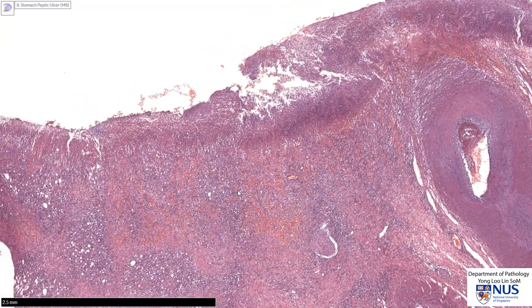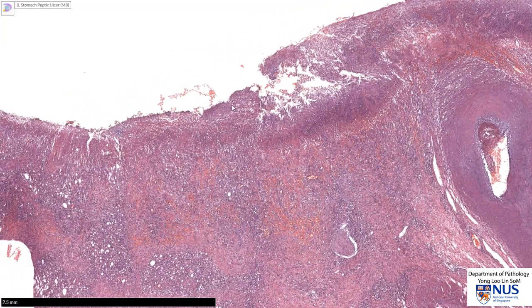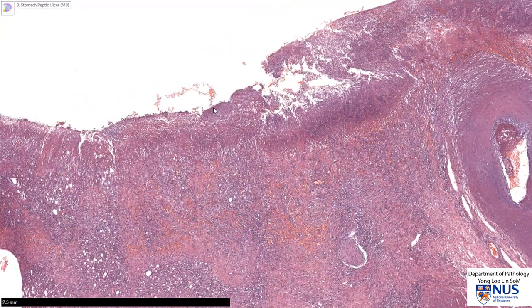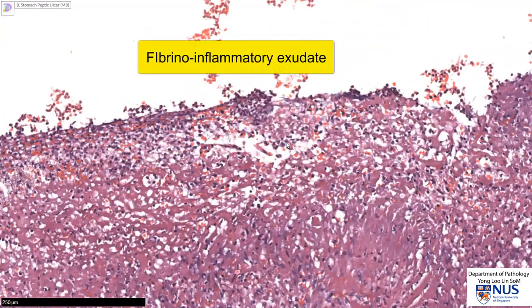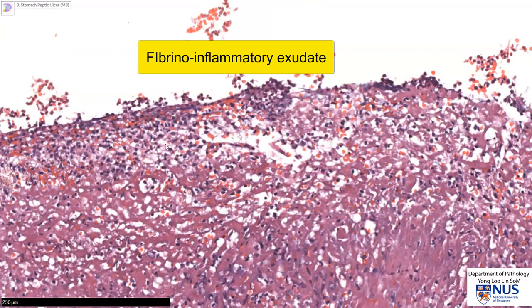Now, let's look at the base of the ulcer. Right on the surface, usually we will see a zone where you can see these pink strands of fibrin — a meshwork of fibrin — and this is mixed with lots of neutrophils. So this is the zone of fibrino-inflammatory exudate.